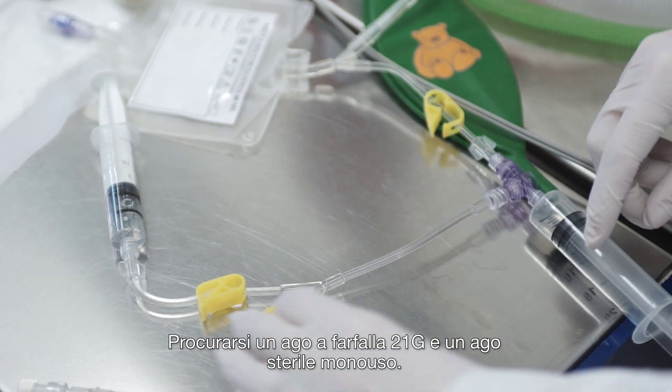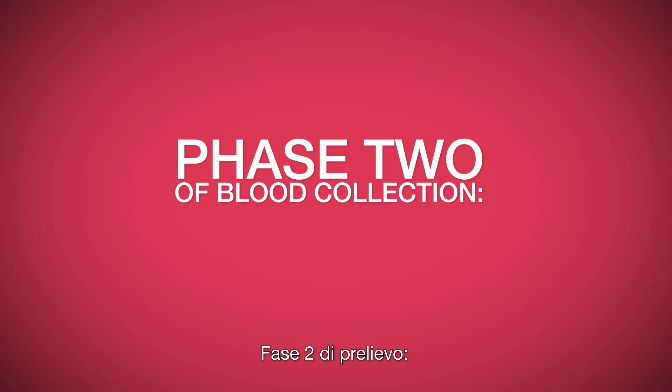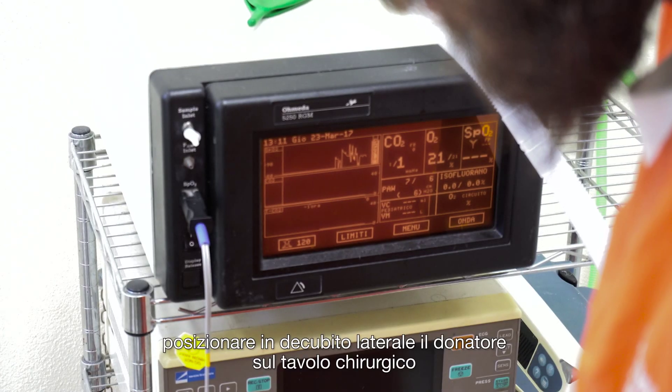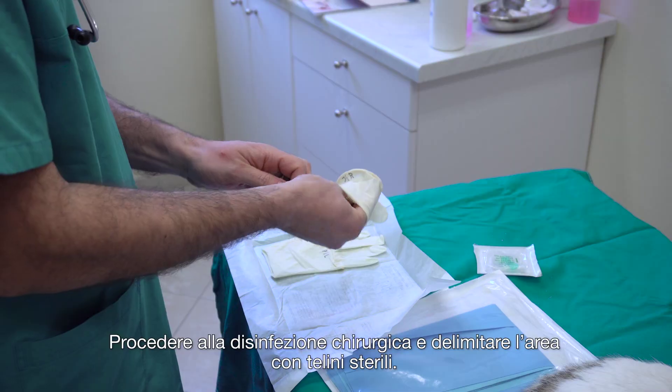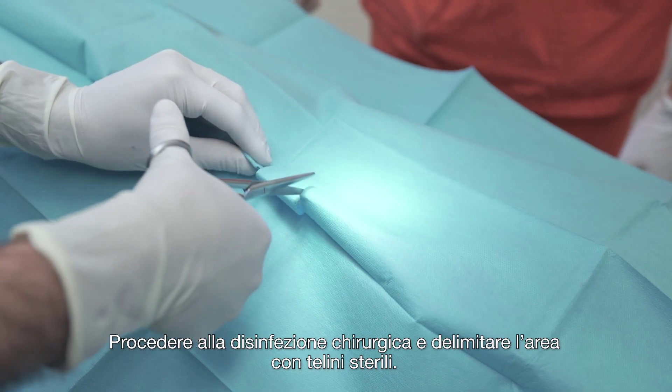Get a 21 gauge butterfly needle and a sterile single-use needle. Place the donor in lateral recumbency on the surgical table and connect it to the patient monitor. Wear sterile gloves. Proceed with the surgical disinfection and delimit the area by the use of surgical drapes.